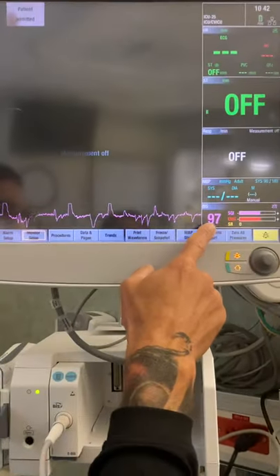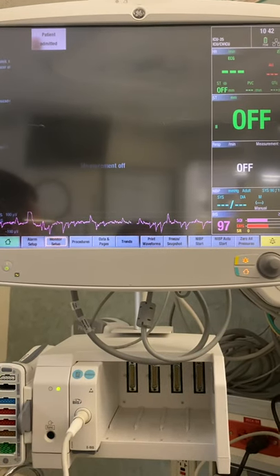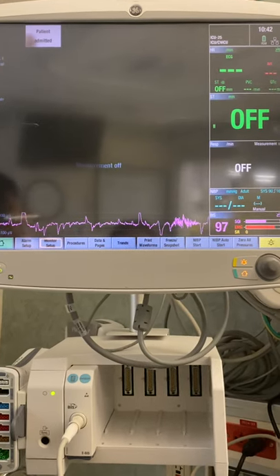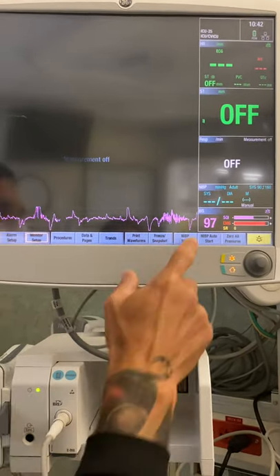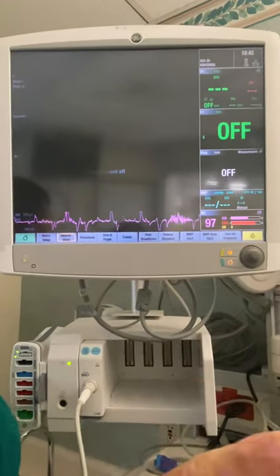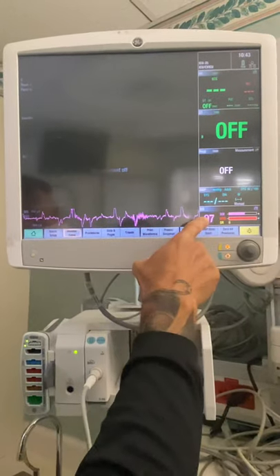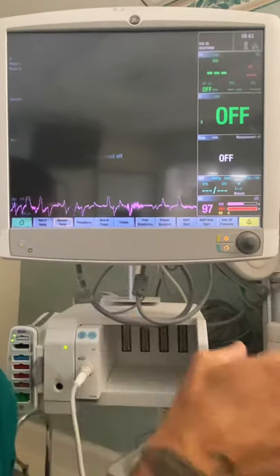Now, let's say that she's at 97 and she's paralyzed. That means that she is fully awake and she knows that we're saying things about her being fat, okay? So make sure that if you're above 60, you are going to up that sedation. I didn't say Megan's fat. I'm just saying in general, our patients. So make sure that if you're above 60, you're gonna titrate your sedation up.